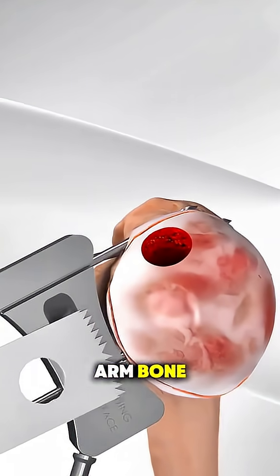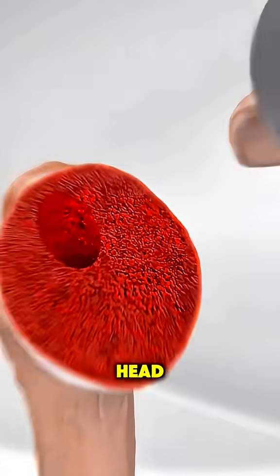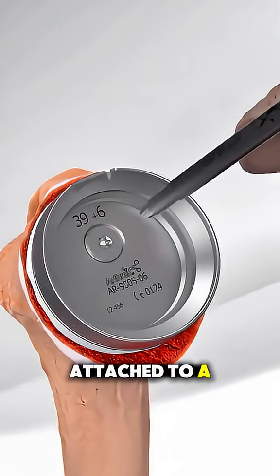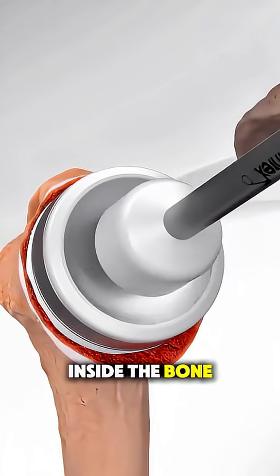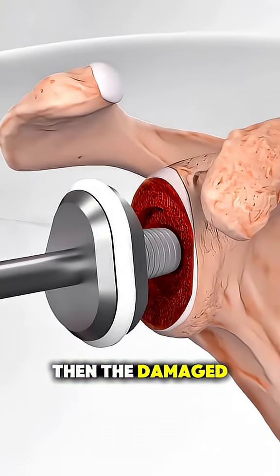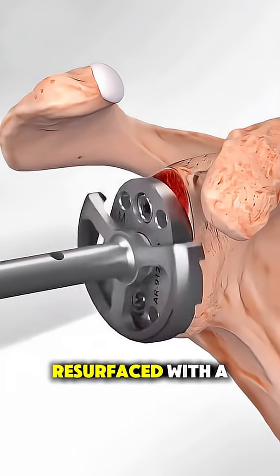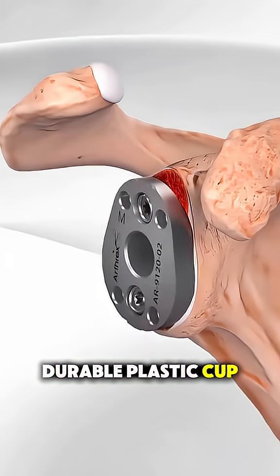The damaged ball at the top of the upper arm bone, called the humeral head, is removed and replaced with a smooth metal ball attached to a stem that fits inside the bone. Then, the damaged socket part of the shoulder blade, called the glenoid, is cleaned and resurfaced with a durable plastic cup.